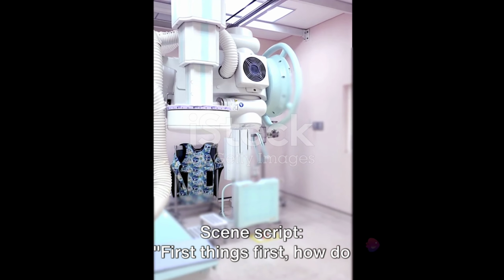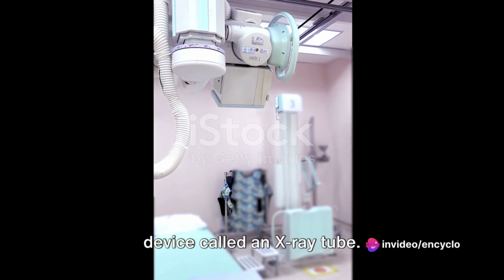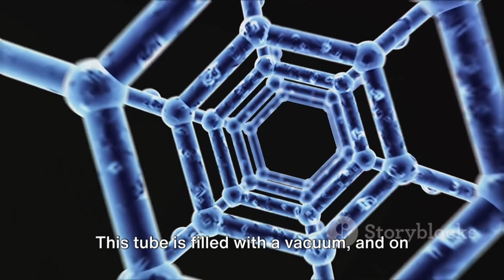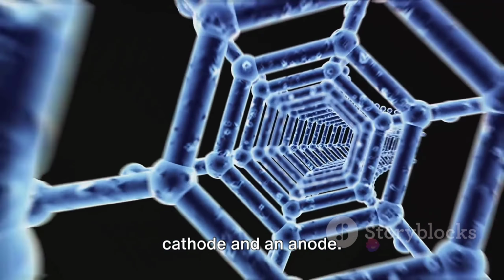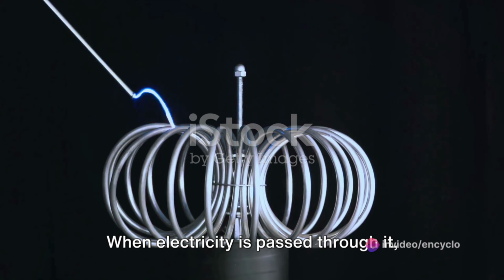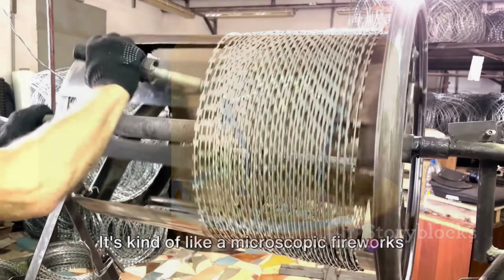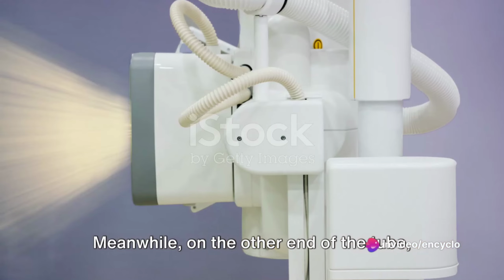First things first, how do these mysterious X-rays come into existence? Well, it all starts with a device called an X-ray tube. Picture it as a sort of high-tech light bulb. This tube is filled with a vacuum, and on either end, it has two electrodes, a cathode and an anode. The cathode, or the negative electrode, is a coiled wire filament. When electricity is passed through it, the cathode heats up, releasing electrons through a process known as thermionic emission. It's kind of like a microscopic fireworks display, with electrons being the sparks that fly off the heated filament.